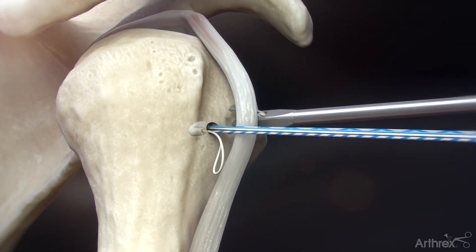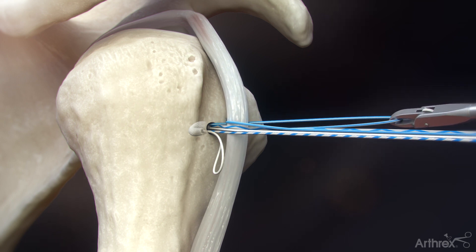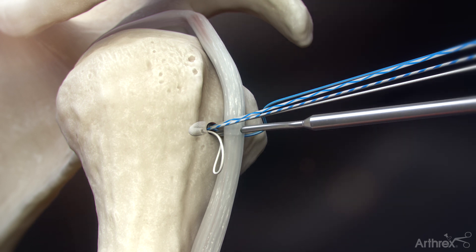Using a suture retriever, shuttle the solid blue fiber wire repair suture under and around the biceps tendon to the opposite side of the white suture loop. Insert the loop-and-tack swift stitch suture passer and penetrate the biceps tendon at the desired tenodesis location.